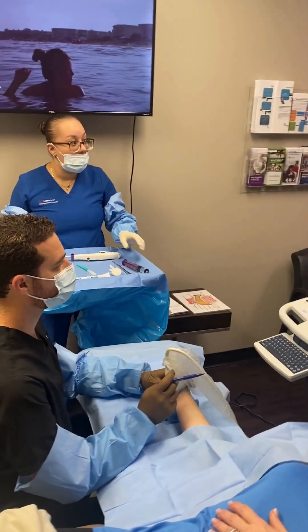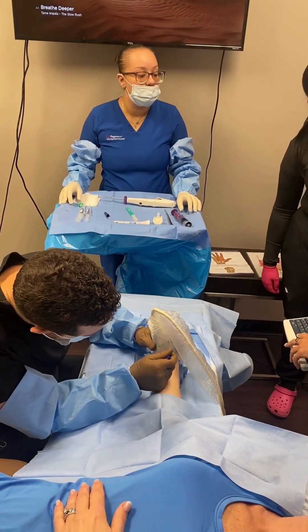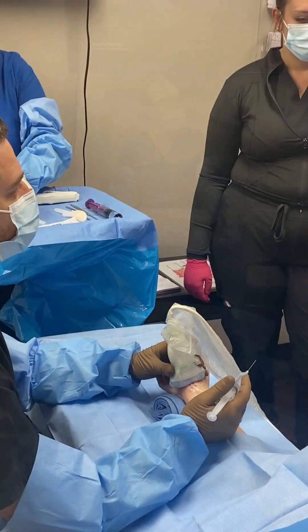This is a live carpal tunnel release procedure under ultrasound guidance. The patient is awake. We scan their wrist and make a couple of markings.